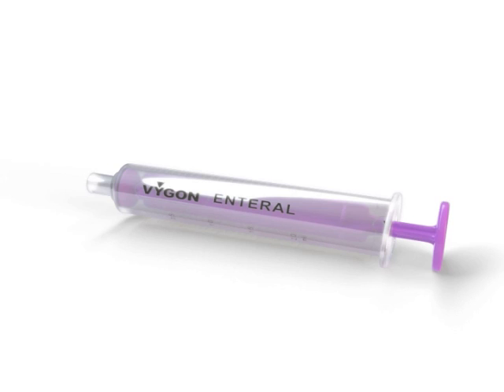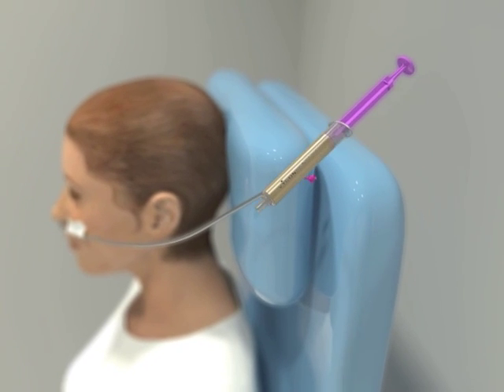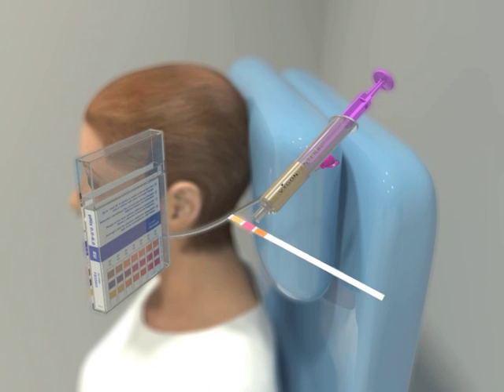The tube position is checked by aspirating gastric content and confirming a low pH on pH indicator strips or paper. Litmus paper is not a sufficient testing method.